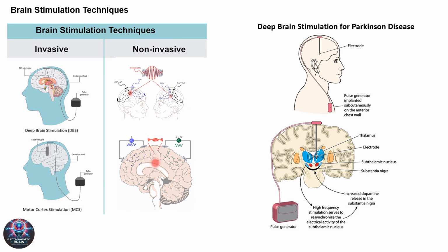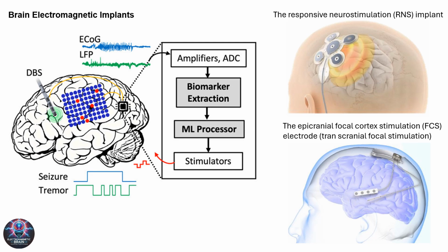In this slide, we delve into the cutting-edge research surrounding brain-computer interfaces, BCIs. The fully implantable wireless brain-computer interface is a major milestone in this field. These systems enable seamless communication between the brain and external devices, without the need for bulky external equipment.